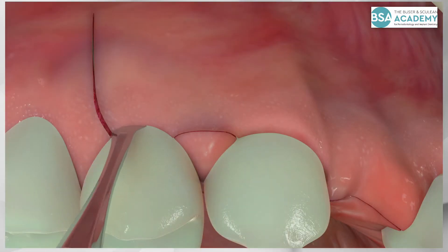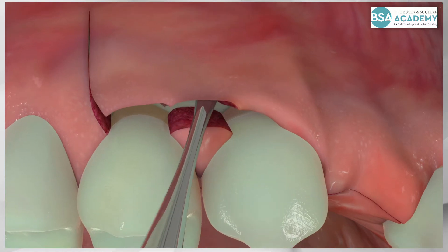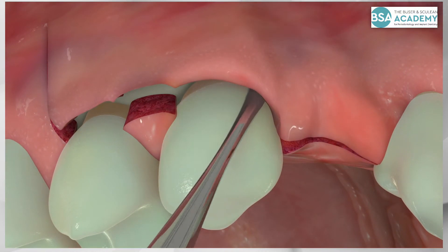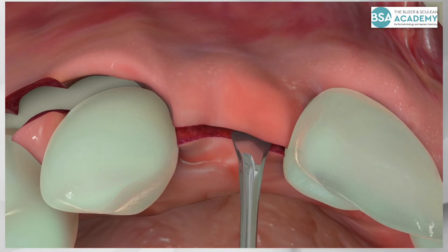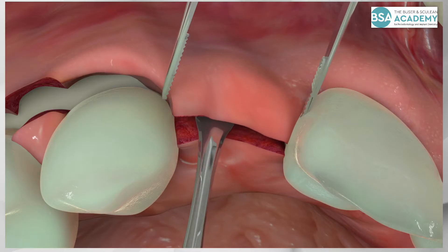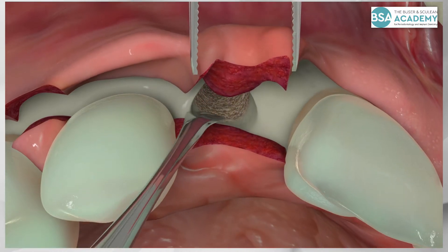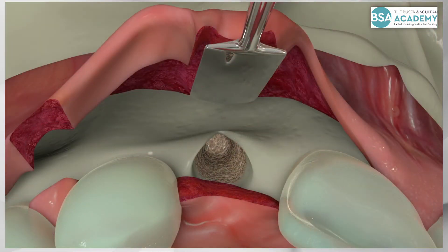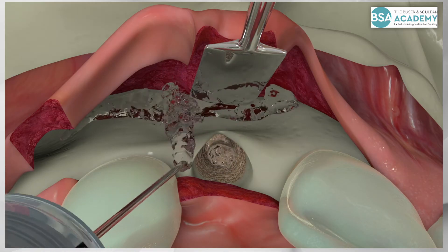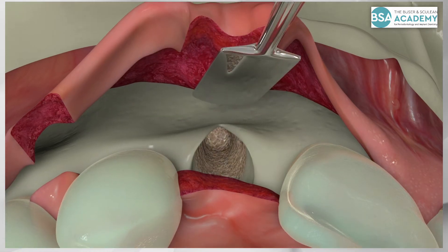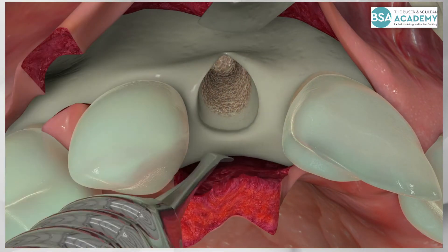The mucoperiosteal flap is now carefully elevated with a fine tissue elevator. In the extraction site, the soft tissue within the former extraction socket is mobilized as part of the buccal flap. This provides a thick soft tissue biotype in the future implant site. The surgical site is exposed and irrigated with sterile saline. The palatal flap is elevated as well to expose the palatal wall of the bone defect.